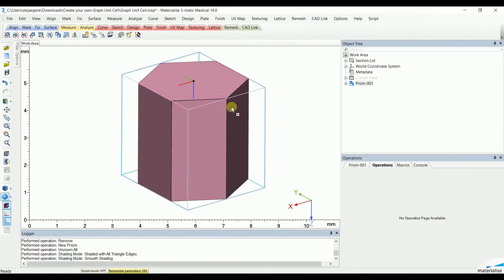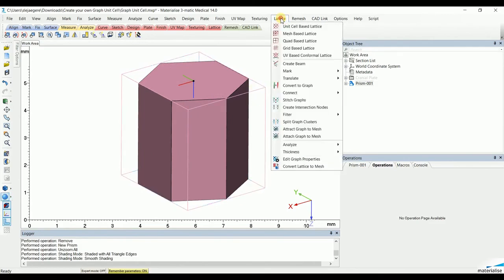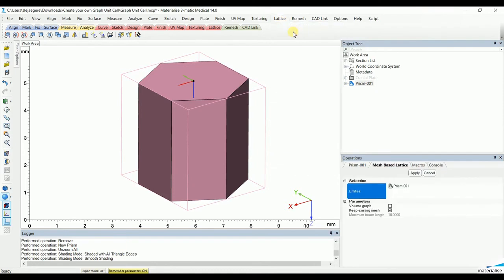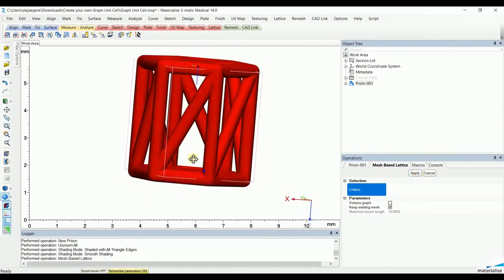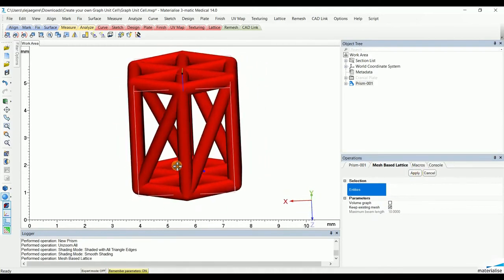To transform that skeleton into a first version of the graph unit cell, go to mesh-based lattice, select the prism, click keep existing mesh, and hit apply. We now see that the skeleton has been transformed into a graph unit.